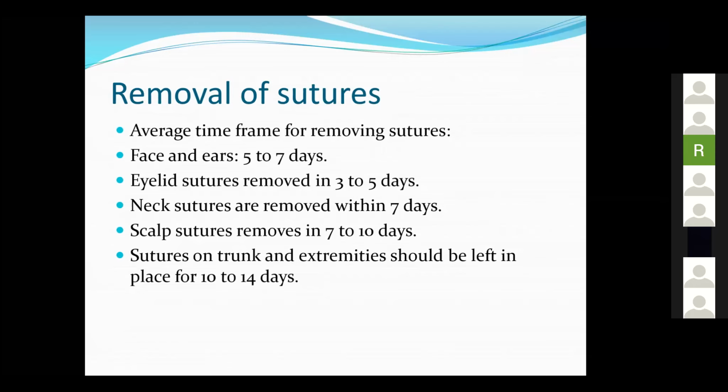Like if the patient is thin and lean, and we have used Prolene for abdominal wound closures, and we do not hide the knot inside the abdomen, and the knot is lying in the subcutaneous tissue, then that thread can peep in and irritate the skin, and the patient gets a little sinus.